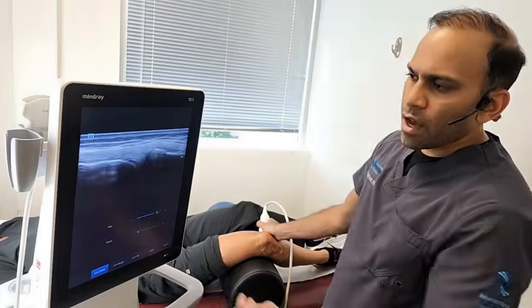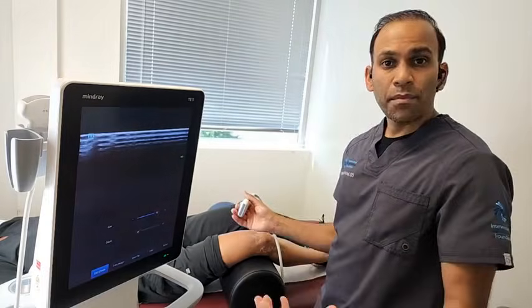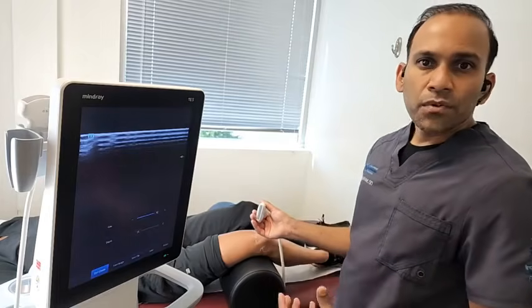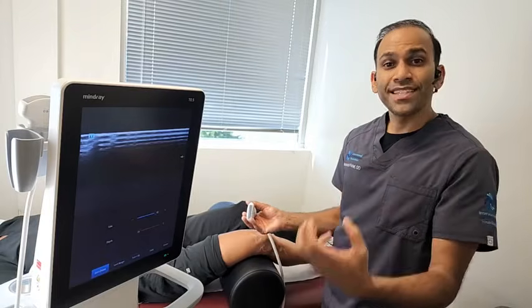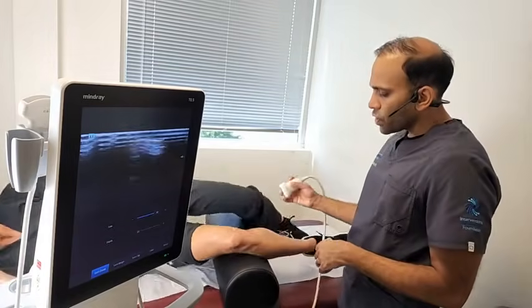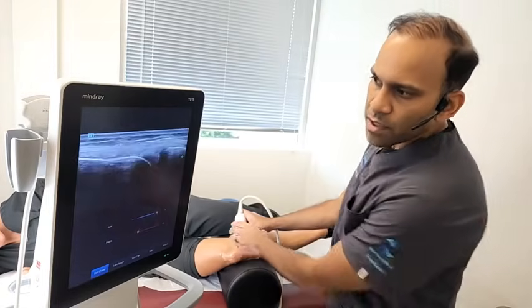Okay. I'm going to show you a little bit of something. Let's see if I can do this. There's ways for us to look at structures like the meniscus dynamically. So we can look at that meniscus as we put the knee into different positions, and that could actually give us a gauge on if that meniscus is loose or if it's unstable, or even if it's causing pain. So do me a favor and lay down on your side facing this way. So what we can do is look at this meniscus as we put the knee into different positions.